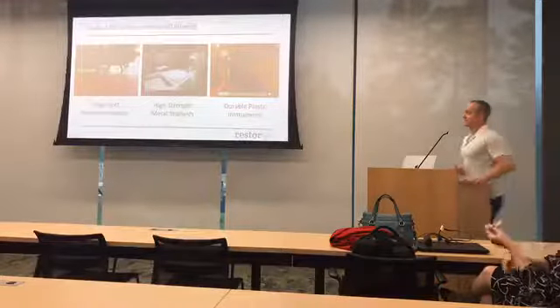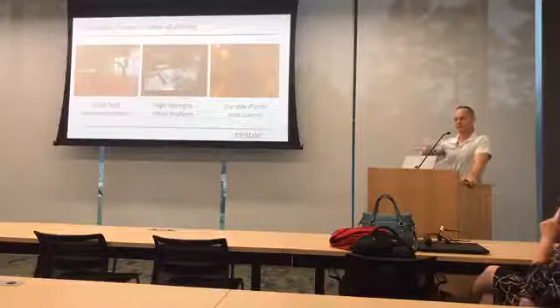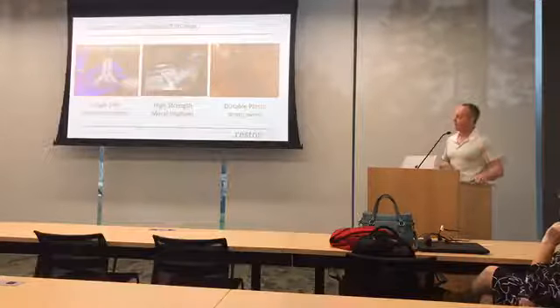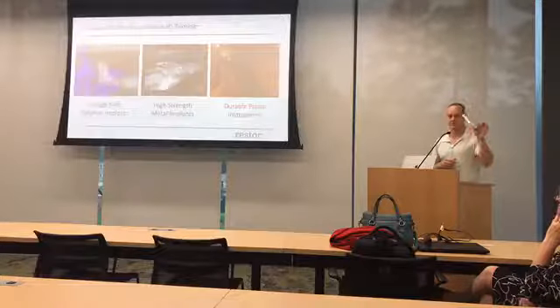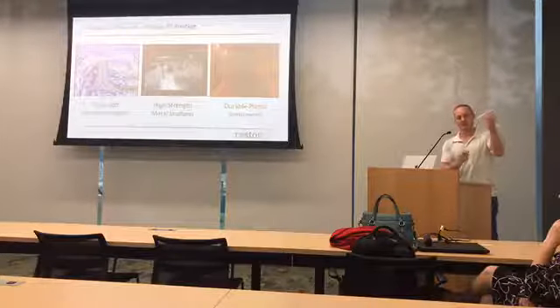The one in the middle is titanium. And that's actually a powder bed process where you use a laser to fuse titanium into a three-dimensional structure. And then the one on the right is we print instruments and things from a plastic material, and that's a resin bed. So that comes from a resin. We transform a resin into something like this, which is an instrument that's used temporarily to insert a spinal cage.